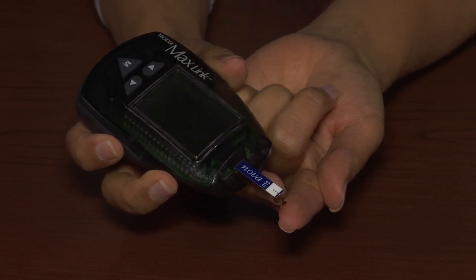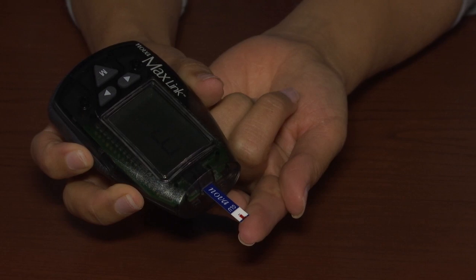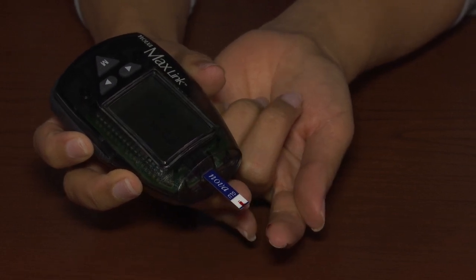When the meter displays the APPLY symbol, apply the drop of blood to the test strip. When the meter displays your result, record it.